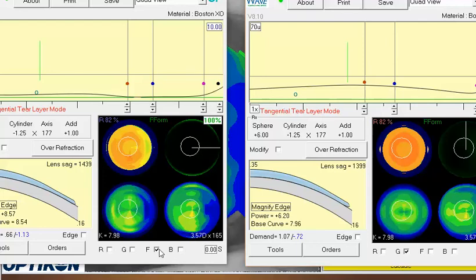And then sometimes I would consider going to freeform, because freeform, if you recall, will let you pick up each meridian and probably get that lens to more closely match that cornea. Remember, we're trying to get this lens using every tool we can to get it to center. So I would consider going to freeform. Definitely go up to the larger diameter, 10 as you did. I would push the diameter even further if you can get away with it. Some of these cases I find myself even going up to almost the entire horizontal visible iris diameter. So I would go 10 to 10.5 if the patient can tolerate it.